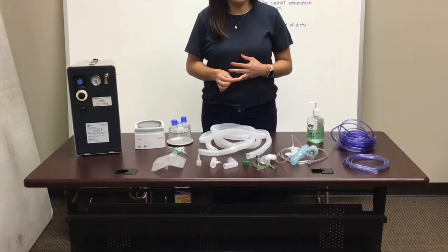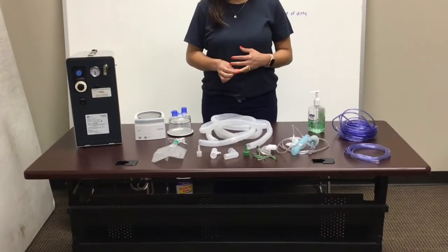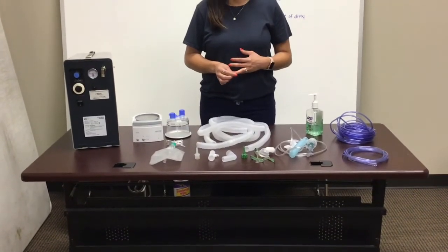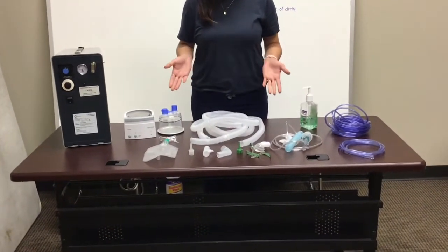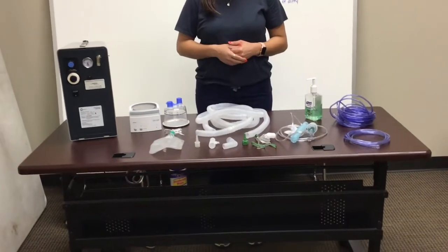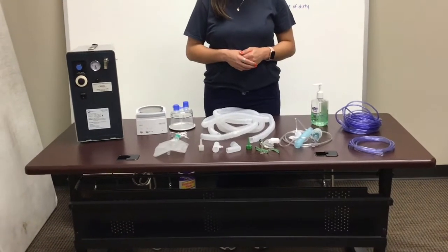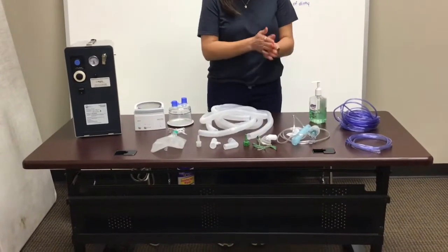Today we will be doing an instructional video on showing you how to set up your heated trach collar mask using your 50 psi. Here are the items you will be needing to do your setup. Before touching any of the supplies, make sure to thoroughly wash your hands or use hand sanitizer.